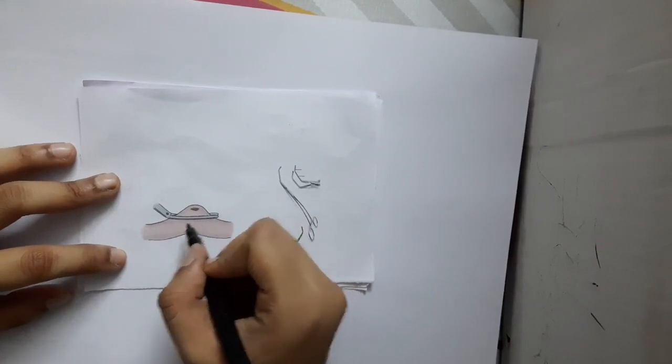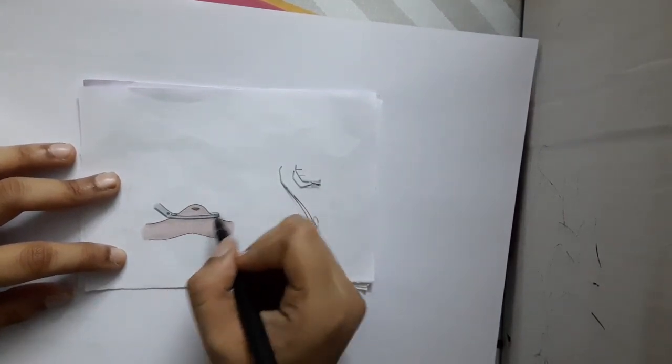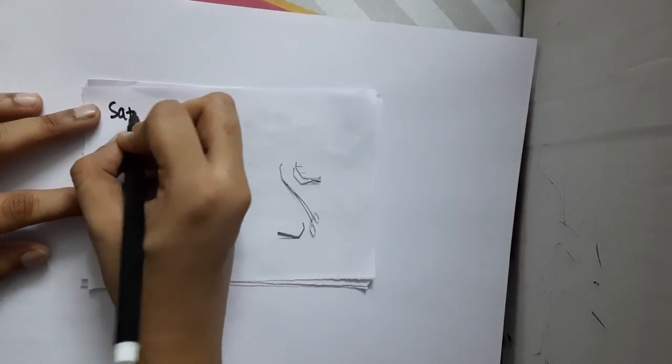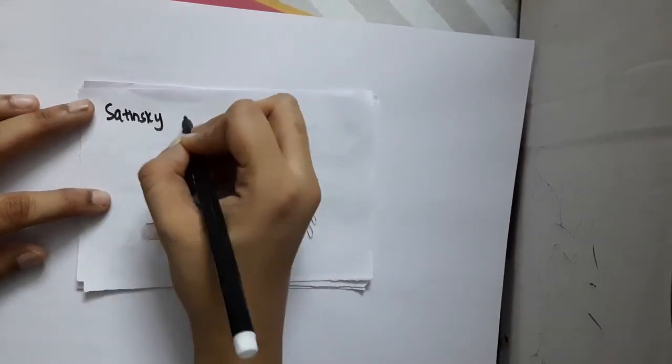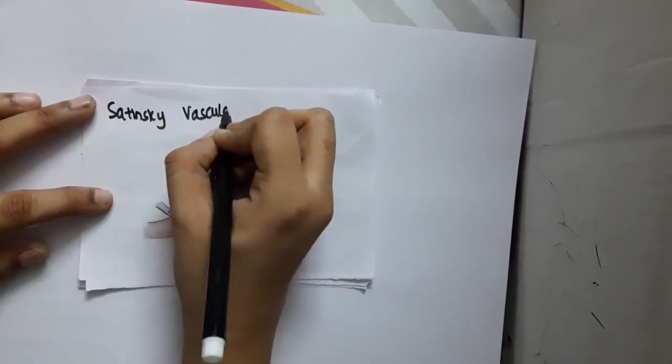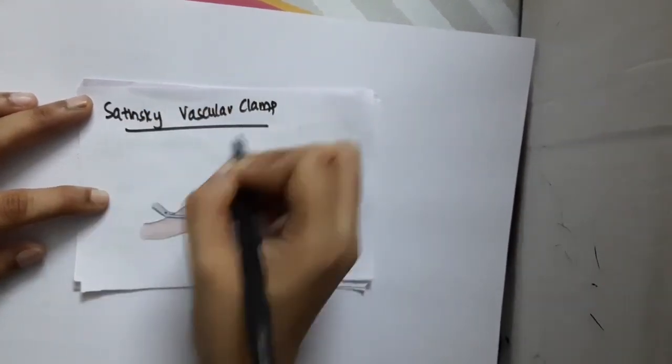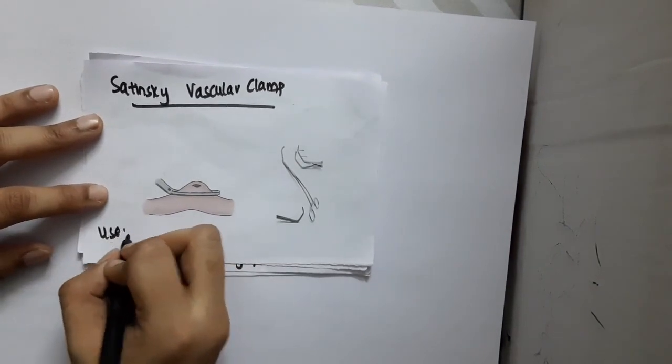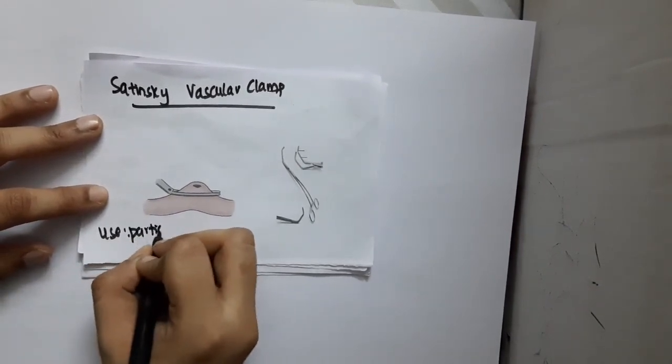This clamp is used like this. This is actually a Satinsky clamp, a Satinsky vascular clamp. What is the use of it? It is mainly used to partially occlude vessels.